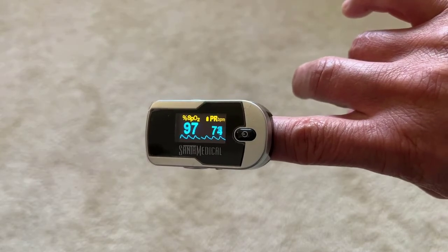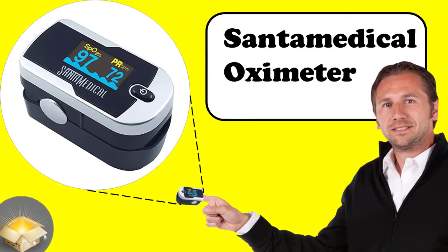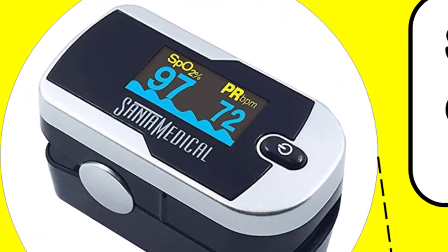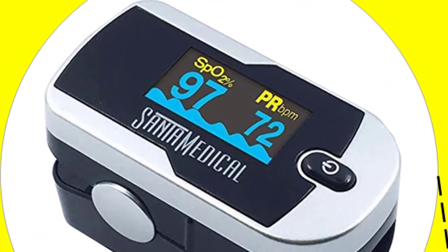So in summary, if you need or would like to check your oxygen level or pulse on a recurring basis, this is a handy little tool to help you monitor and record your vitals.